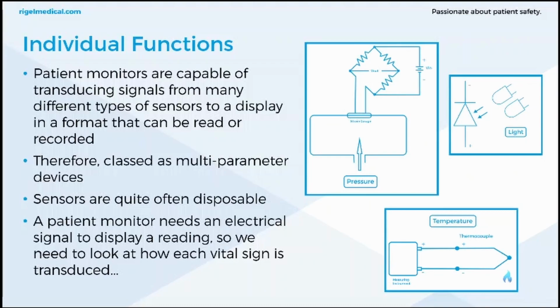If you've been in a fire, the levels of oxygen can be misconstrued. So there are ways of establishing what types of hemoglobin are in the blood using different wavelengths of light.